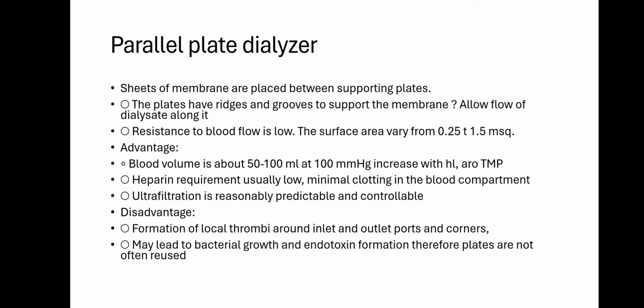The disadvantages of the parallel plate dialyzer: the formation of local thrombi around the inlet and outlet ports of the dialyzer and the corners. It may lead to bacterial growth and endotoxin formation. Therefore, the plates are not often reused.